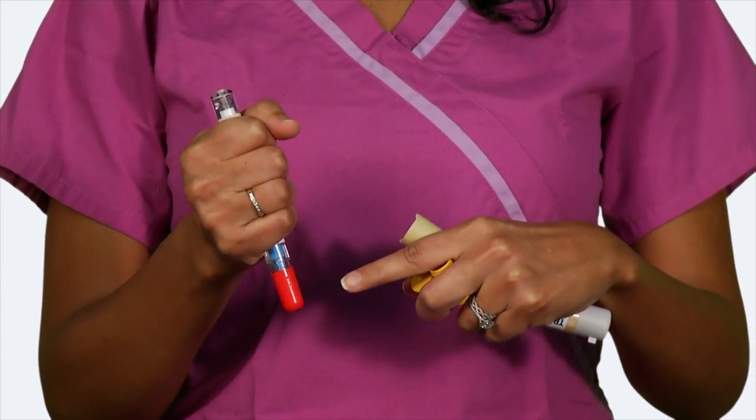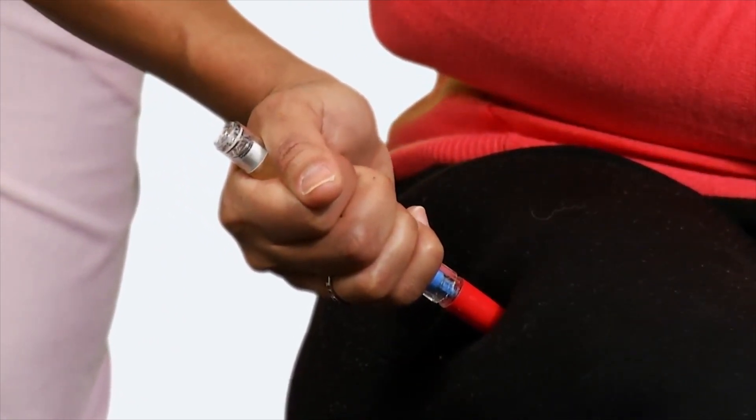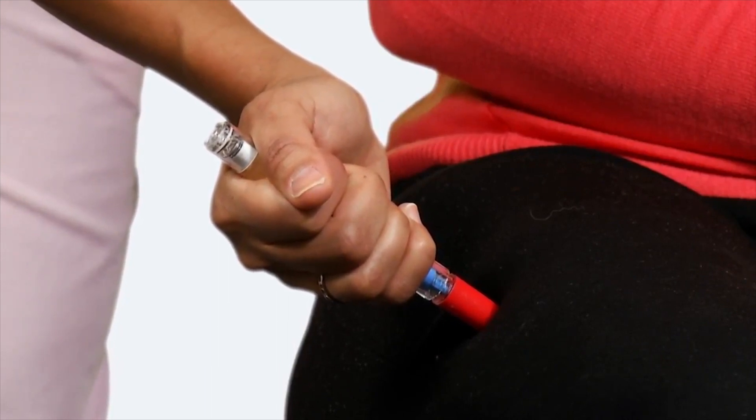Never put your thumb, fingers, or hand over the red tip. Grab the auto-injector with your fist with the red tip pointing down. Put the red tip against the middle of the outer thigh at a 90 degree angle. Press down hard and hold firmly against the thigh for 10 seconds.